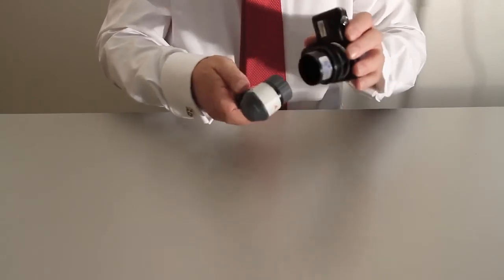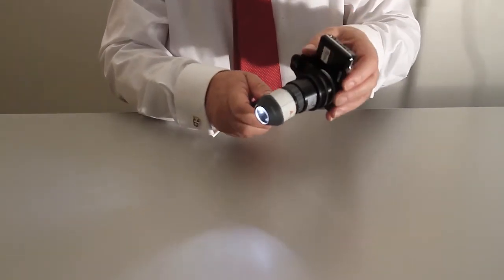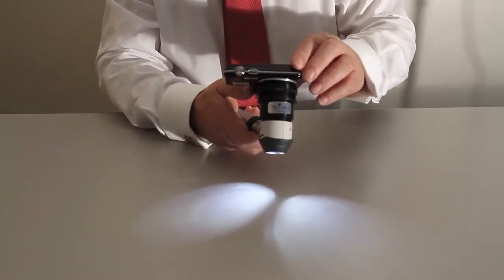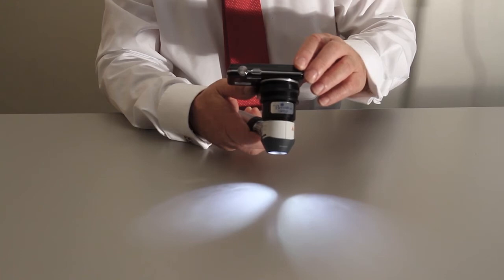Then you can fit the two devices together. It just slots onto the dermatoscope like this, and away you go. You can expand the image as necessary.